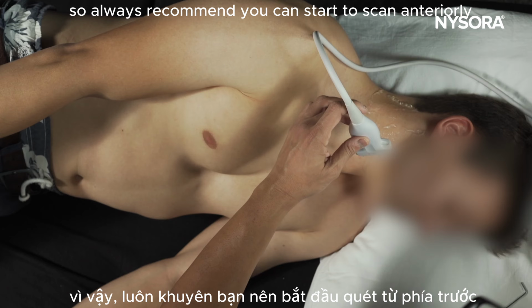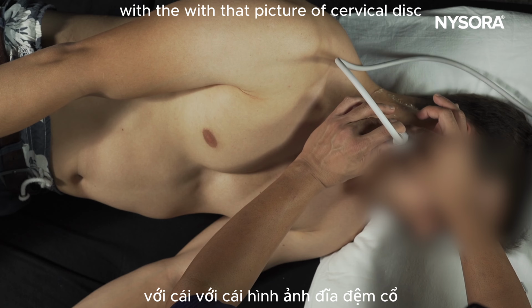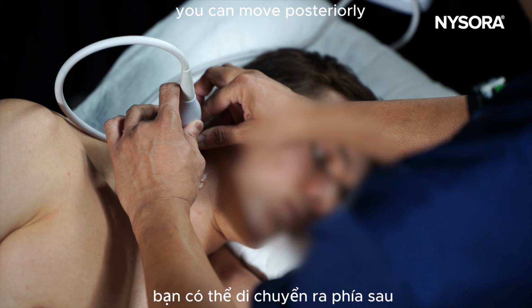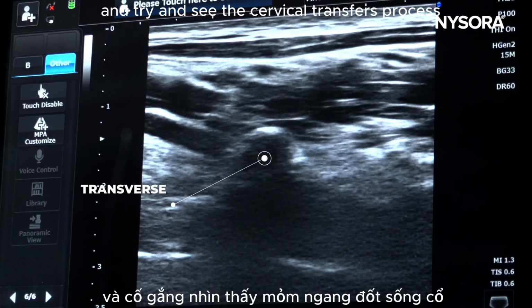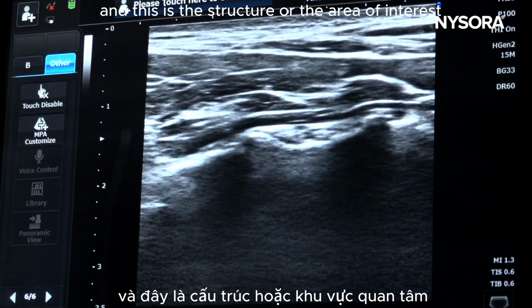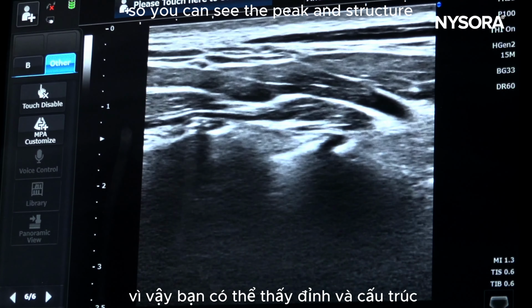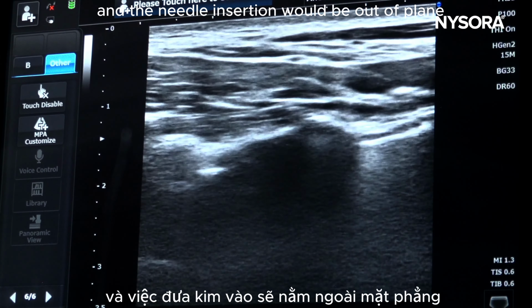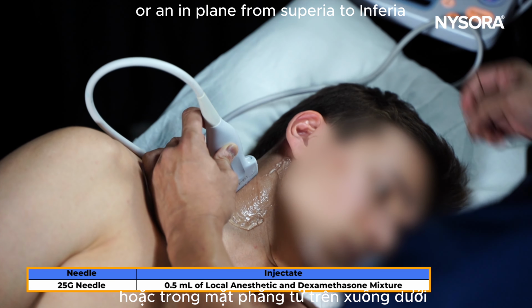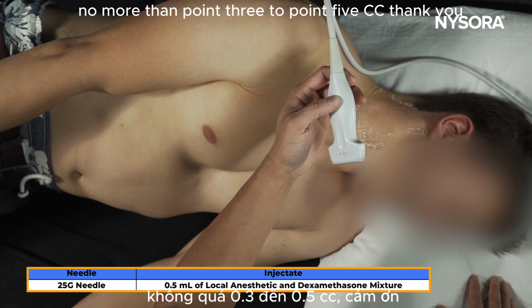So I always recommend you start to scan anteriorly with that picture of the cervical disc, and then you know, okay, you're way too anterior, you can move posteriorly and try and see the cervical transverse process, and then you can move posteriorly, and this is the area of interest. This is your cervical facet joint column and the articular pillar. So you can see the peak and trough structures here, and the needle insertion would be out-of-plane or in-plane from superior to inferior. The local anesthetic and steroid mixture should be no more than 0.3 to 0.5 cc. Thank you.